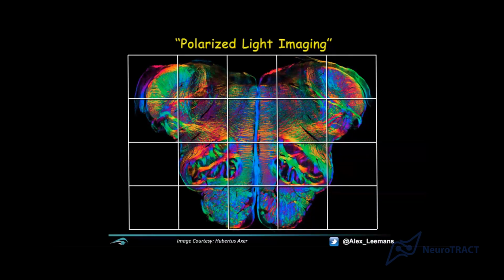So if we look at these results, looks great. Another point I want to make is look at the heterogeneity of pathways within a voxel. So if you were to increase the resolution with diffusion MRI, even to the micrometer level, you would still have the potential of pathways crossing at that location. Okay? I mean, even axons themselves can branch.